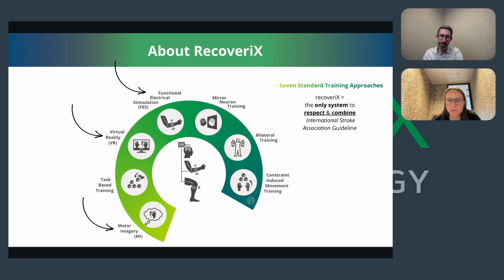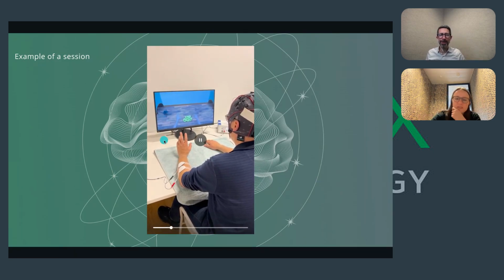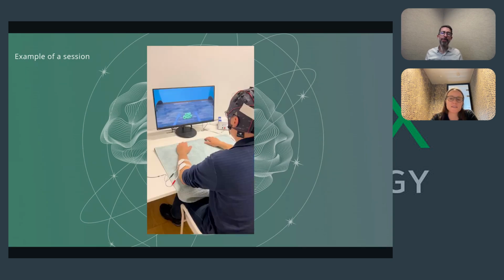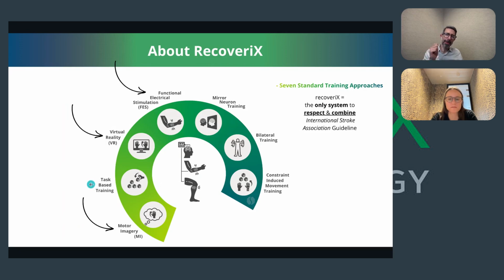Task-based training is sometimes catching a ball, or trying to chase away a rat. It's this very precise task. You have seen the cheese on the screen. So basically we make it a bit interesting and say, you don't want the rat to get to the cheese, so you're going to shoo the animal away. There's cheese in the middle, there's a little rodent coming in, and then as the hand moves up, it gets scared and runs away. And sometimes it's a ball. There are different tasks, different animations. We also have people playing the drums. So with one arm they play, and then with the foot they do the other movement.